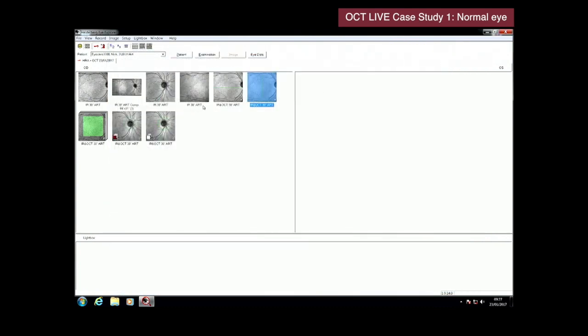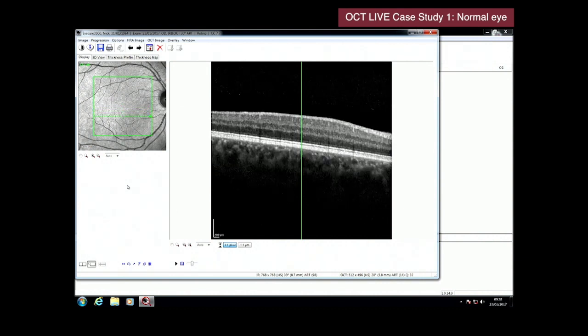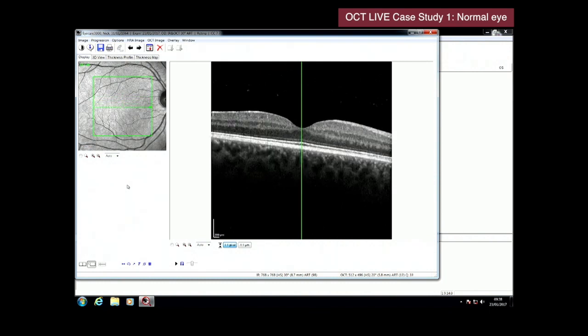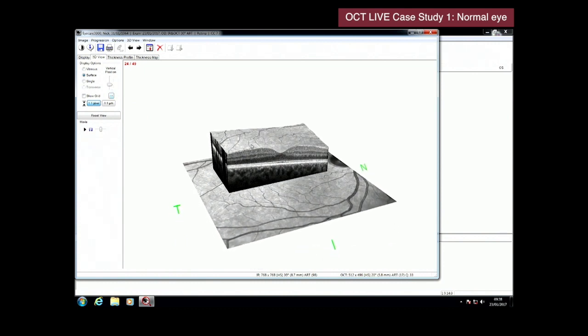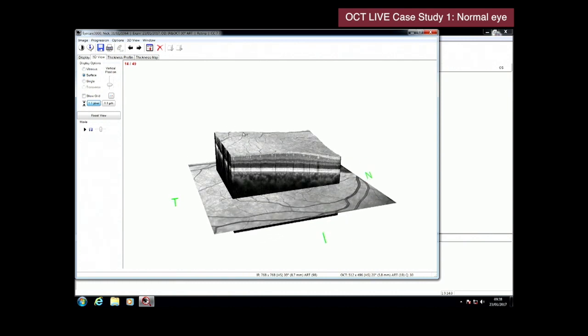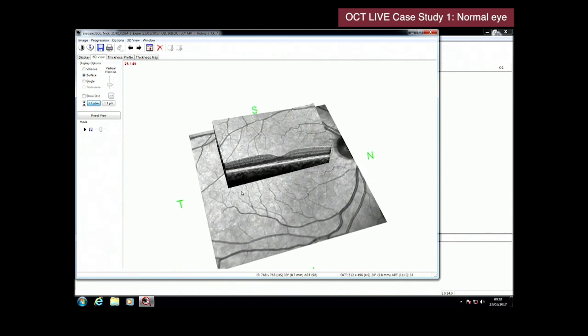Okay. Finally, the volume scan. Multiple cross-sections at different locations. We're averaging 16 frames per cross-section. The line scans were 100 frames in each location for very, very high quality. We can look at this as a three-dimensional image, and this is extremely useful for patient education to explain some of the abstract concepts associated with ocular disease. Patients are often very familiar with a fundus recording, but less familiar with an OCT scan, so it just helps with that explanation of the changes that you might be observing.